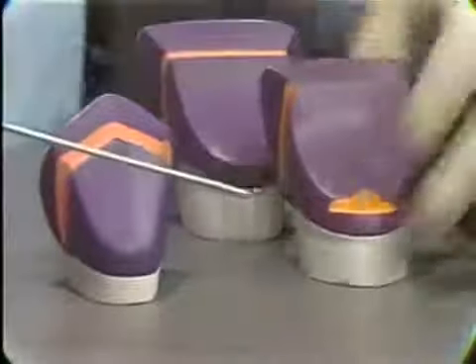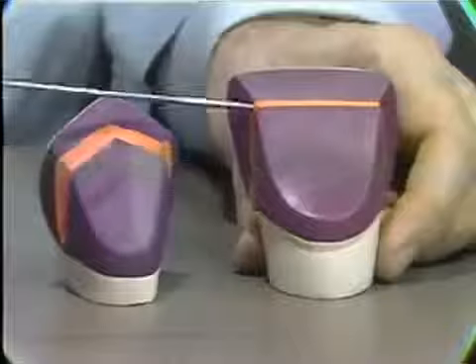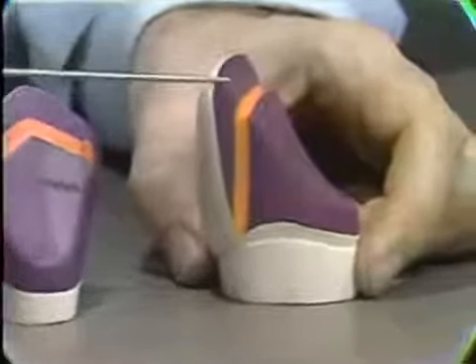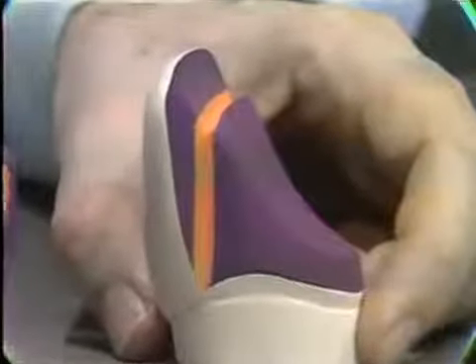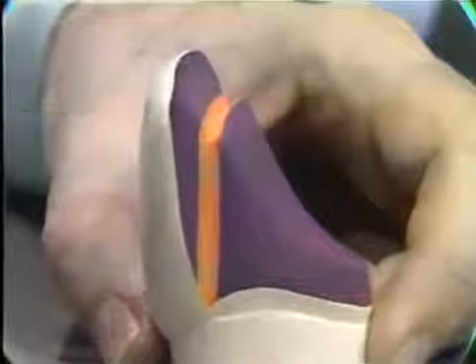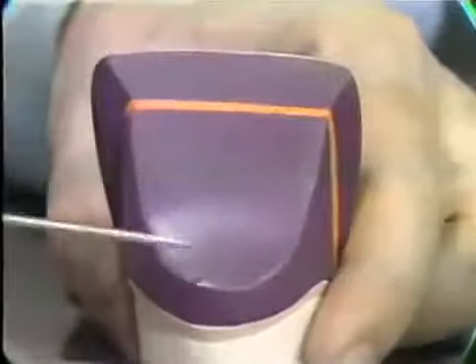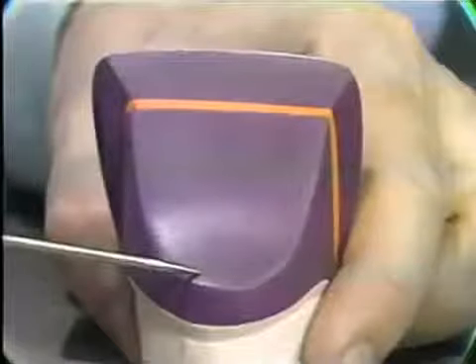Here's another three-quarter crown on a maxillary incisor of the more standard type, with both proximal grooves and an incisal groove running across. Notice the protection of the incisal edge here, which is kept to a minimum so as not to interfere with the labial aesthetics of the tooth. Notice the necessary thickness of tooth left in here so that the cement lute on this surface will not show through any translucent incisal edge. Here again, a recess and a pin will be cut where this is to be used as a bridge retainer.